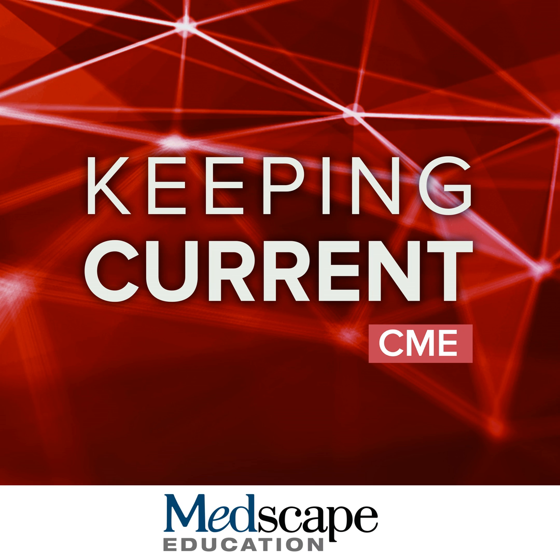So for optimal ARIA detection, we want, again, a consistent standardized approach that includes a consistent set of sequences, sequence parameters, field strength, and vendor over serial exams in a patient. And this can be achieved using dedicated imaging protocols, as well as triaging patients to a specific set of scanners if feasible within your practice. And this all must be done with the awareness that many practices are also having the need to accommodate increased MRI scan volumes.